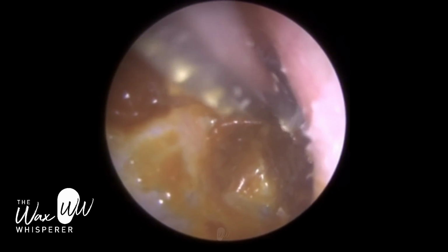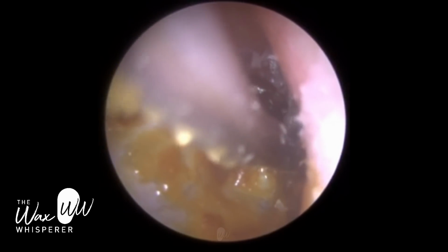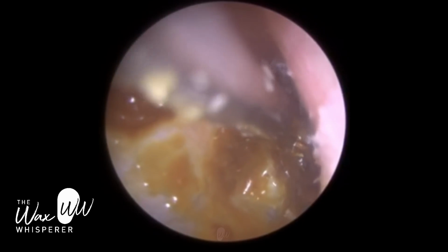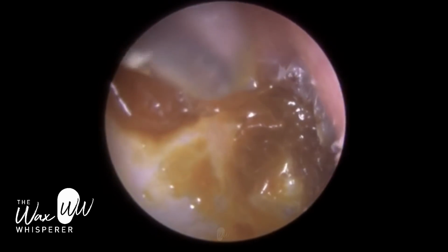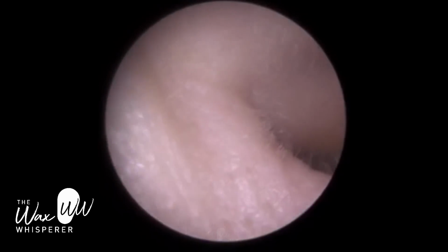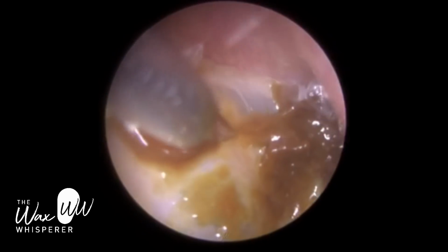And again, with this ear, the patient didn't drain the ear. They actually allowed the drops, with the head tilted, I think, overnight. The drops softened the wax, and the wax just drizzled further down the ear canal onto the eardrum. And we're just in the anterior recess there. As I mentioned in the previous video, you've got an inferior and anterior recess. And look at that view.